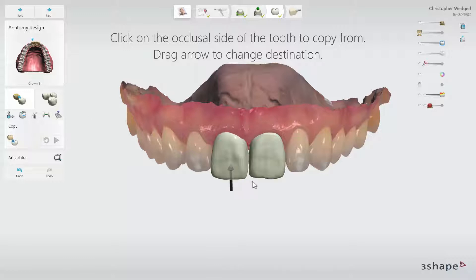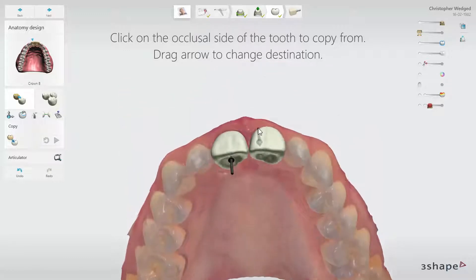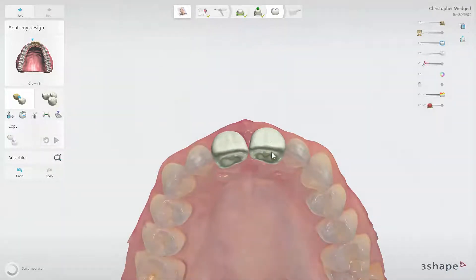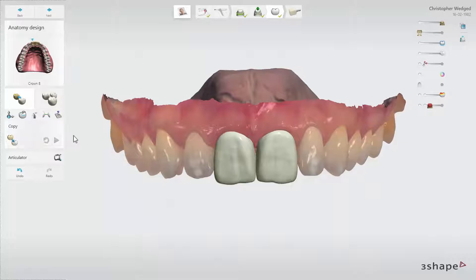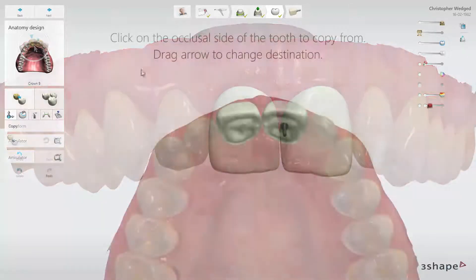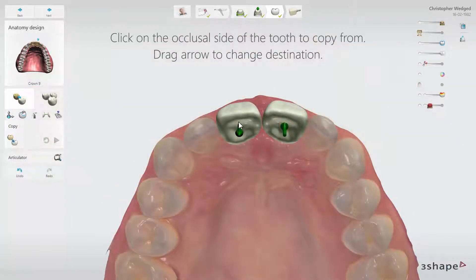Move the black arrow over the incisal edge and click it. Once you do that, the design will be copied immediately. To select the tooth that you wish to copy to, click on the tooth or choose it in the tooth selector. You can also change this by dragging the arrow between the teeth.